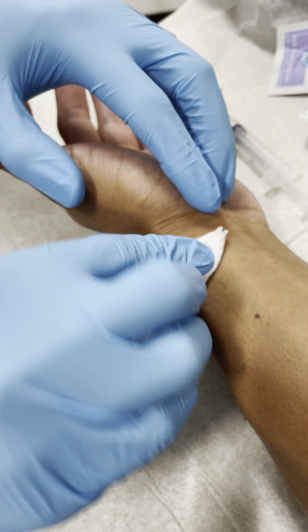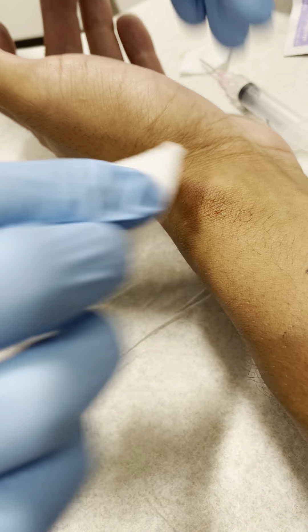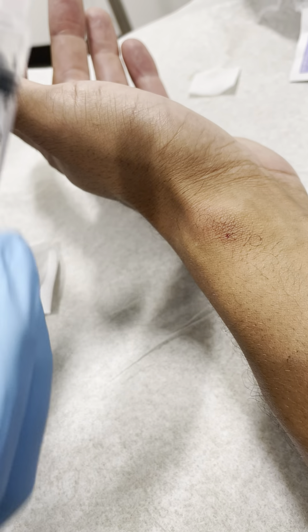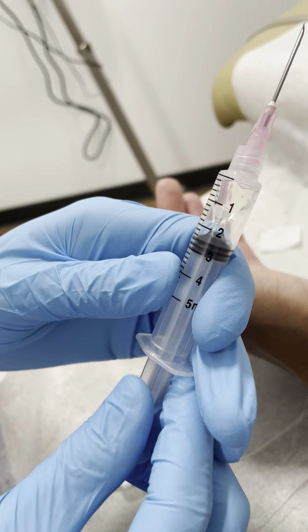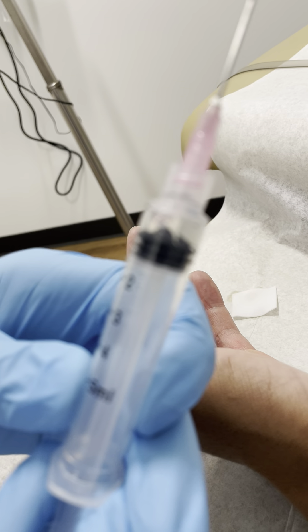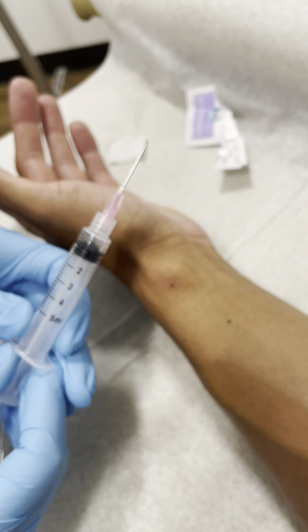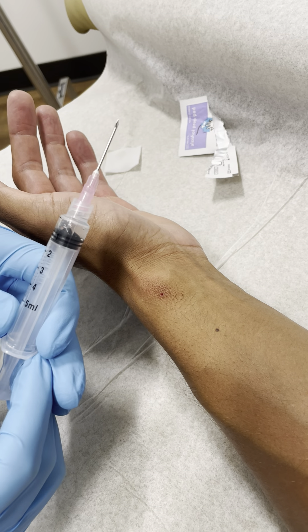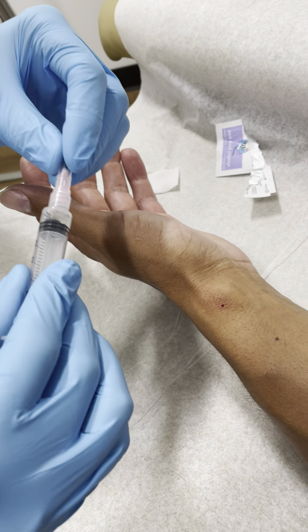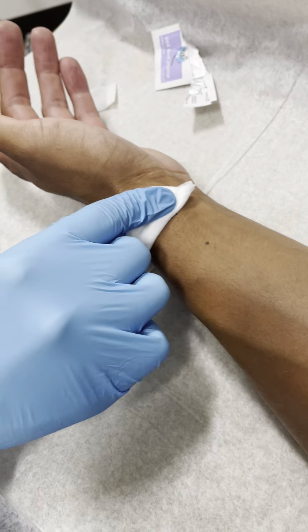We did a good job getting the vast majority of that material out. The suction was able to get most of it — I'd say there was roughly a half to three-quarters of a milliliter of fluid in there. We'll put a cap on the needle, place a bandage on there, and call it good.